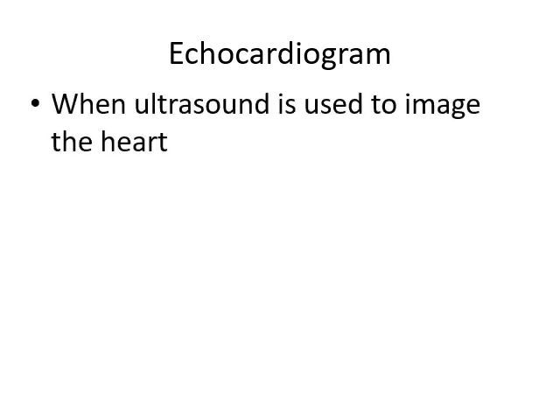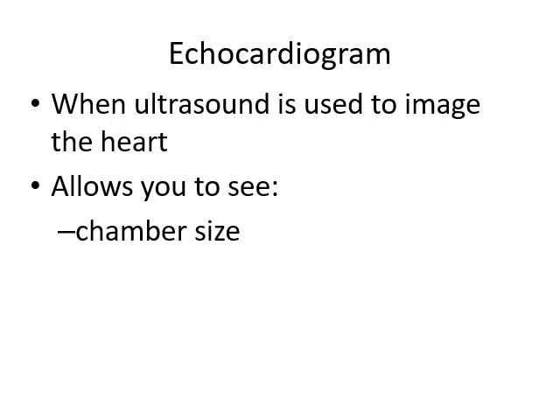So it's basically used to help you see different things. So you want to see how big, or like the chamber size. You want to see if all the chambers are within a certain range of correct size, right? Because you don't want one chamber to be way out of whack with where it should be, because that's a problem. You want to just be able to see how the heart is functioning, to see if it's just, you know, smoothly beating, not jiggling and doing all sorts of stuff.